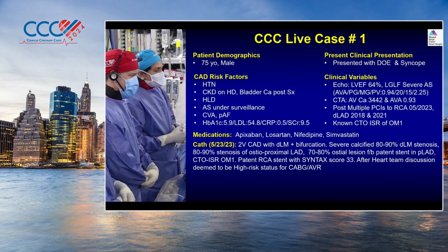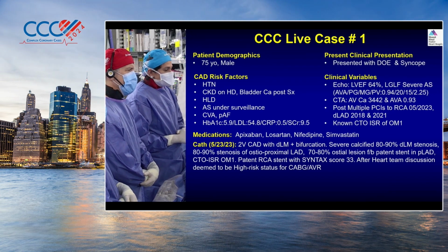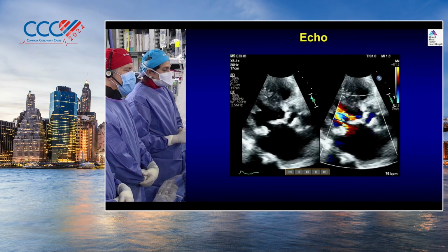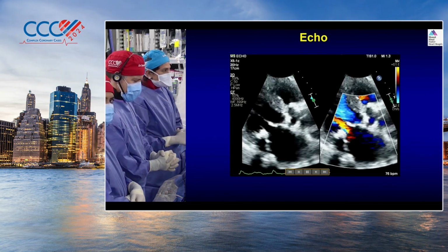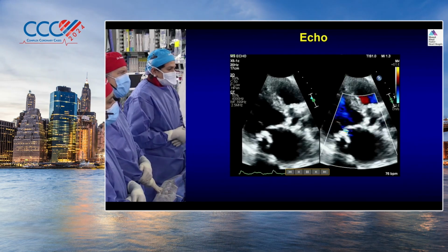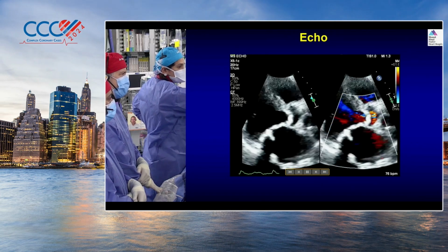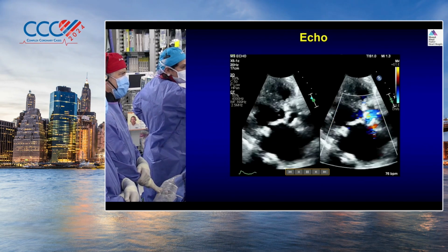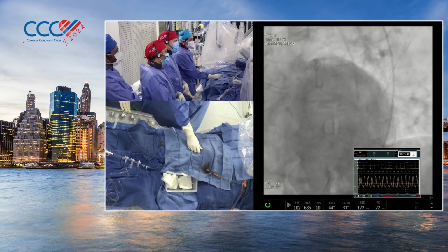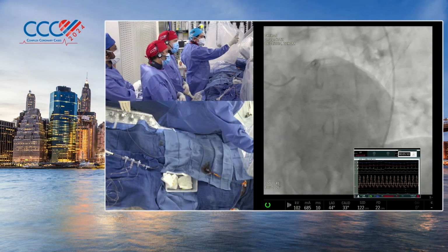If you see the echocardiogram, like I mentioned, his gradients are not high, but the valve calcium score on the CT scan was over 3,000, 3,400, which shows that it is actually severe. So here we are today with this man. I'm going to show you the angiogram, and then we can have our discussion. This is distal left main with ostial LAD, and about 50% ostial circumflex.